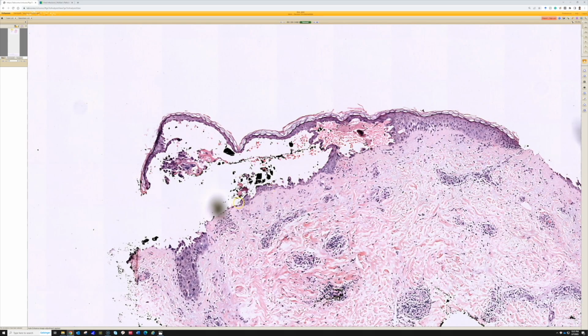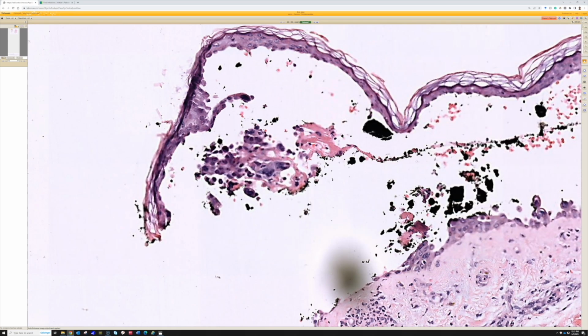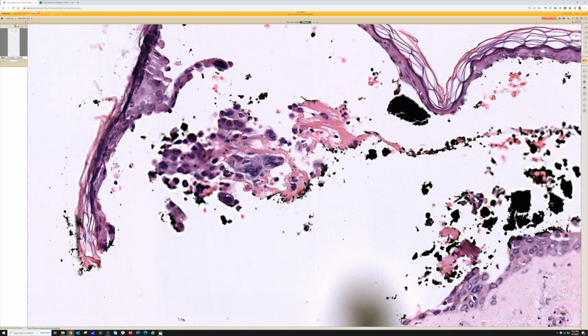There's some basal layer keratinocytes retained down here on the floor of the blister, and the roof has separated. And in the blister cavity, you can see, once it comes into focus, that there are free-floating keratinocytes here that have detached from one another. So that's acantholysis. So there are some immunobullous diseases like pemphigus, for example, that can have acantholysis and blistering. But this is not immunobullous. This is actually a viral disease.